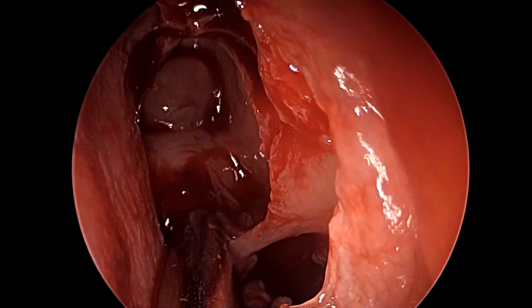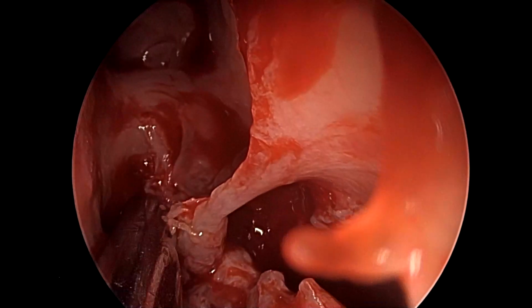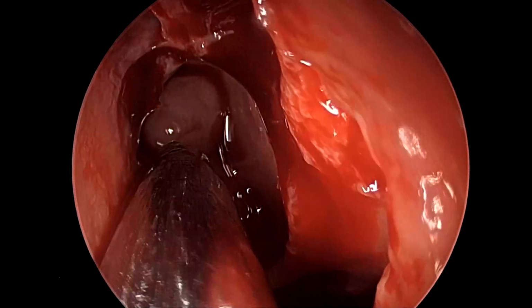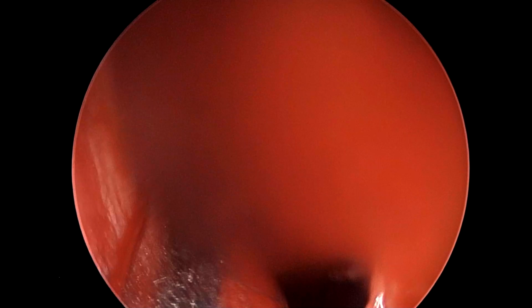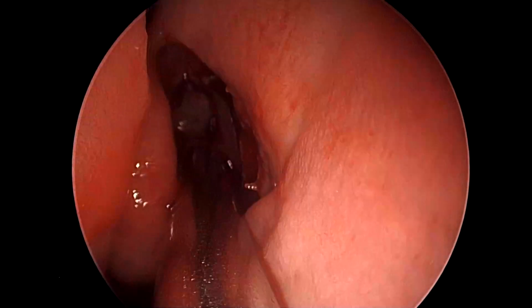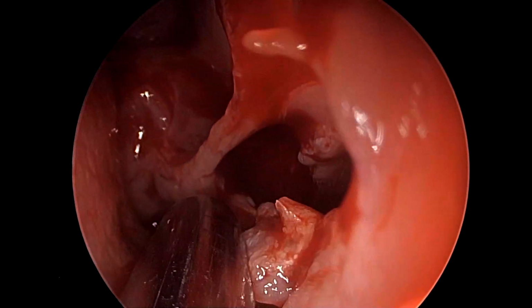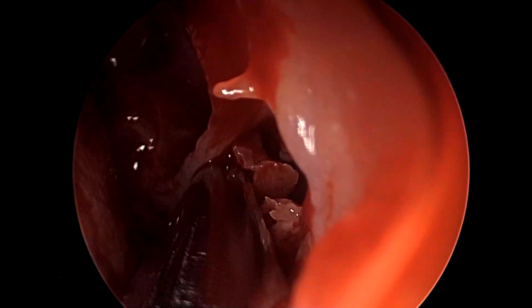Though it is still to be repaired, the leakage of CSF is not so much of a concern as an inadvertent opening of a vessel that could be lying loose inside the meningocele. These vessels are notorious to retract inside the cranial cavity and cause bleeding, which would definitely create a lot of problems.